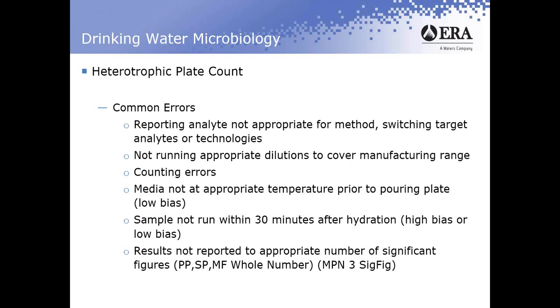It's not uncommon to see acceptance intervals at 2 standard deviations that are very similar to chemistry. So this can be a very tight sample. So what are some of those errors that we do see?